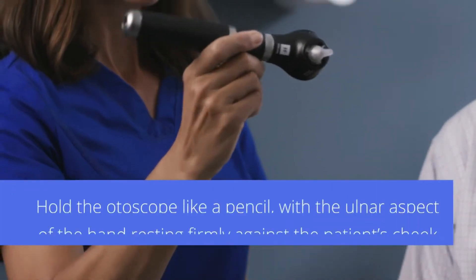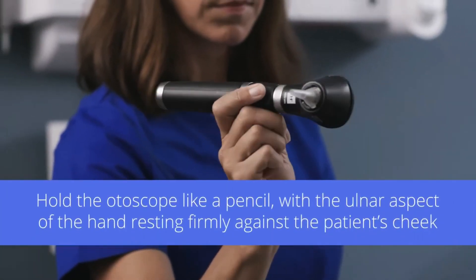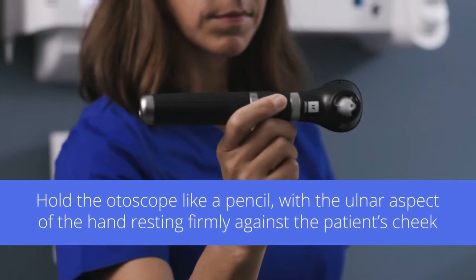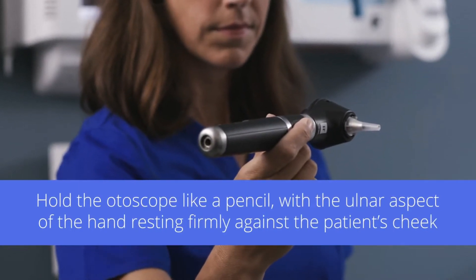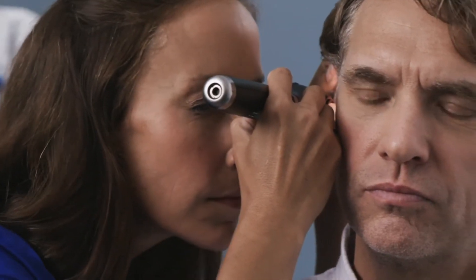For more control, some clinicians choose to hold the otoscope like a pencil, between the thumb and forefinger, with the ulnar aspect of the hand resting firmly but gently against the patient's cheek. With this technique, if the patient turns or moves, your hand can move with the patient's head to prevent injury.